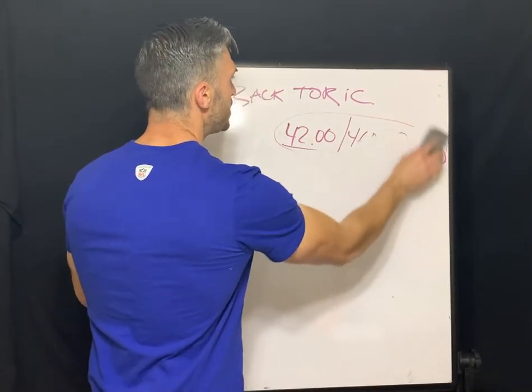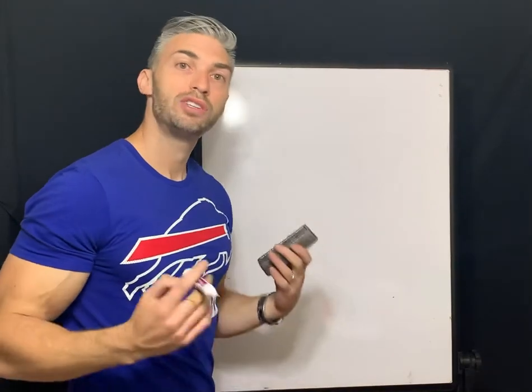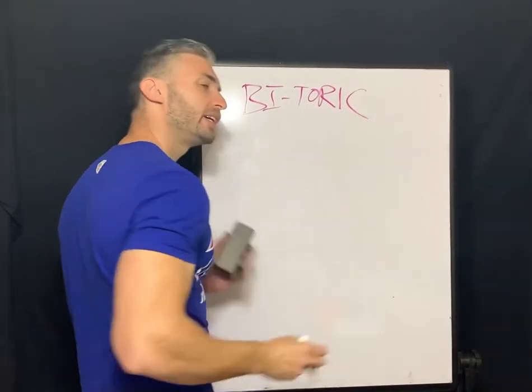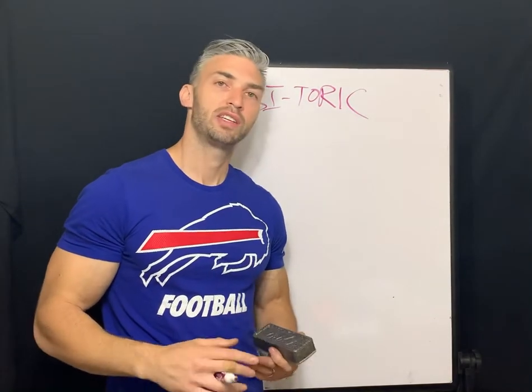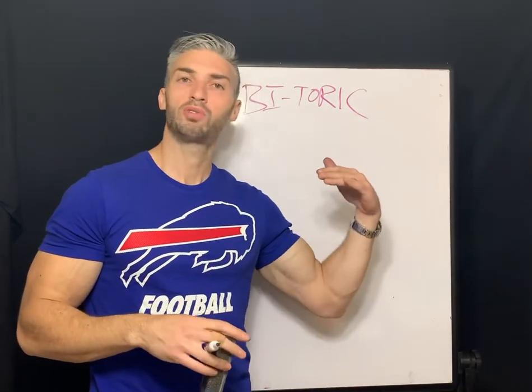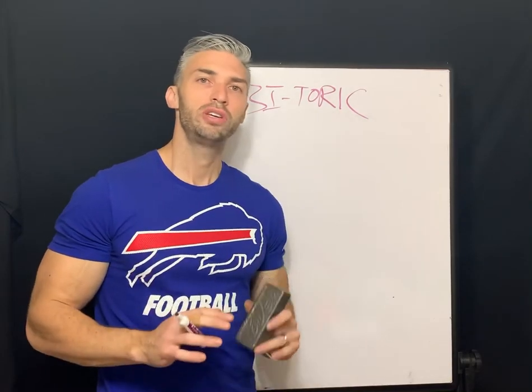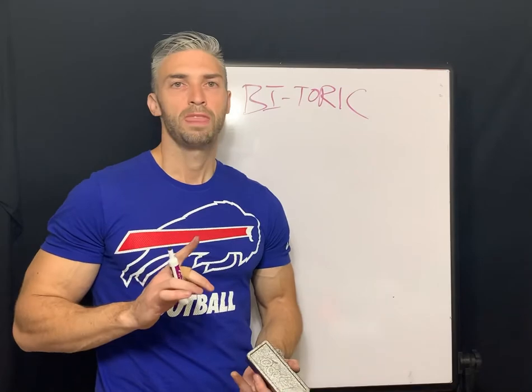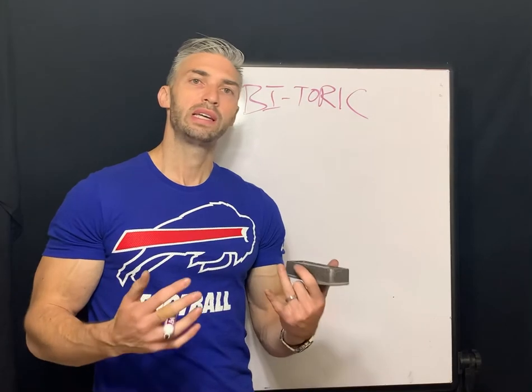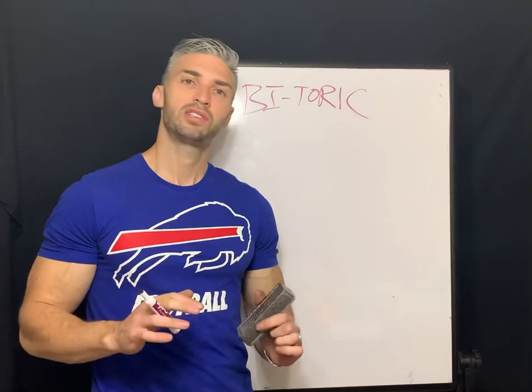And now we are going to get to our last type of contact lens we're going to talk about today, which is a Bi-Toric contact lens. And shockingly, just like the name suggests, you have a toric front surface and a toric back surface of the lens, right? You have multiple radii of curvature on the front as well as on the back. You're going to use these if the front toric, the back toric, or the spherical gas permeable aren't working well. You could always lean on a Bi-Toric lens. These are so customizable, especially nowadays, so it's a great lens to go to.